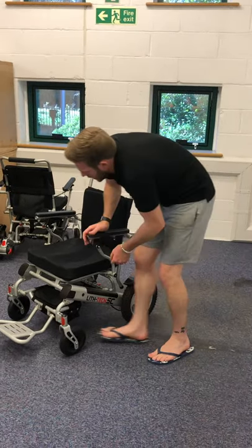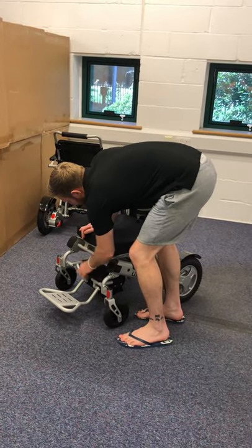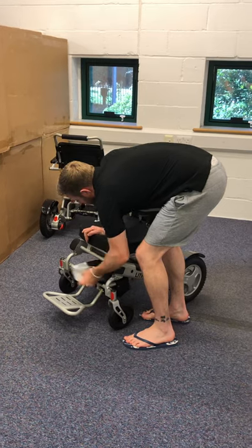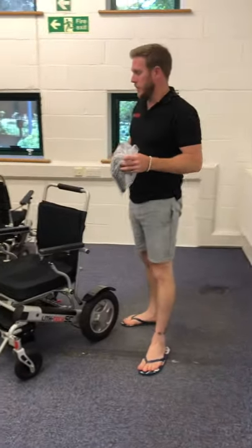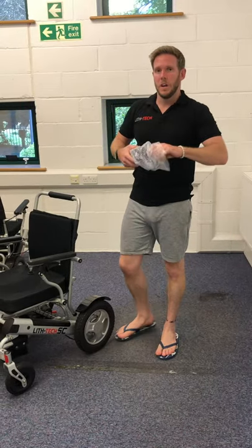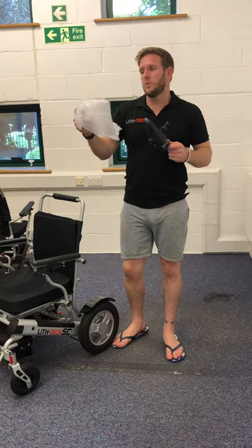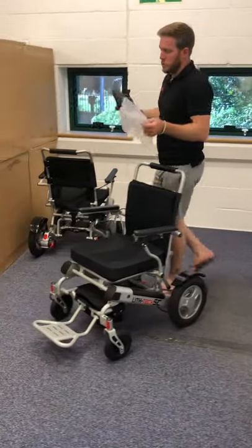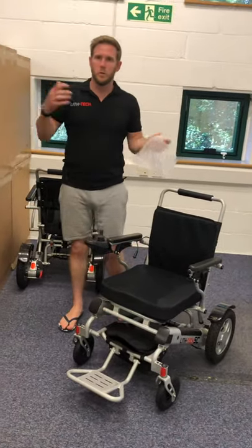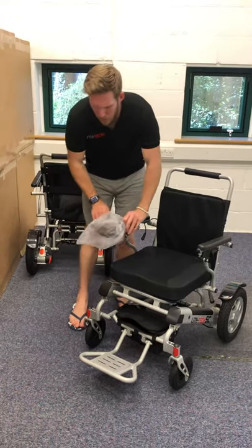The joystick is kept in here. When you're at home there's no need to take it off; the only time you need to remove it is when folding and putting the chair into the car — this makes the folded dimensions smaller and protects the joystick. When the joystick is under the chair please put it in the bag. The bubble-wrap cover also doubles as a rain protector for the joystick — if you get caught out in the rain, reach between your legs, grab it, and put it over the joystick.